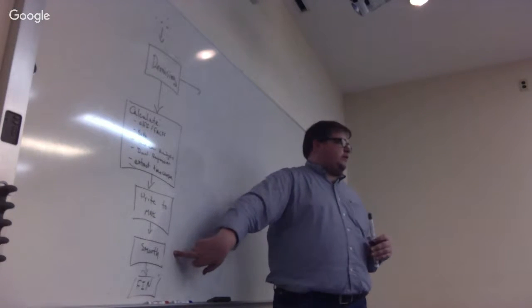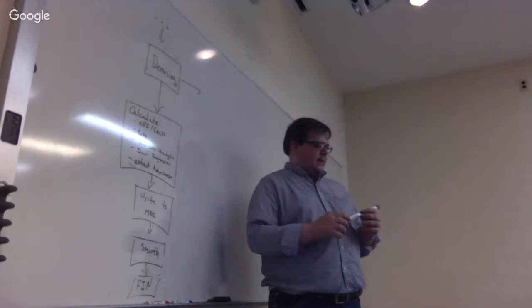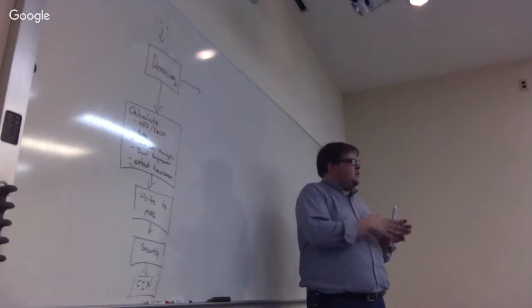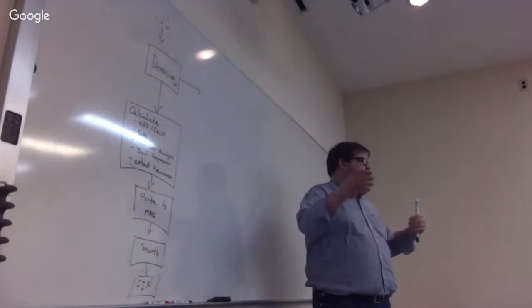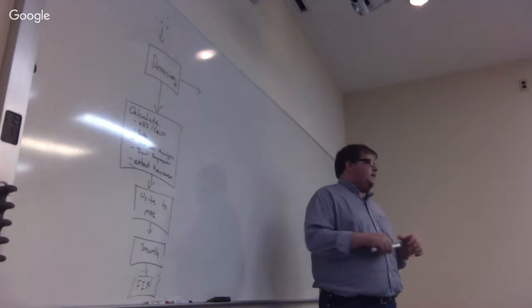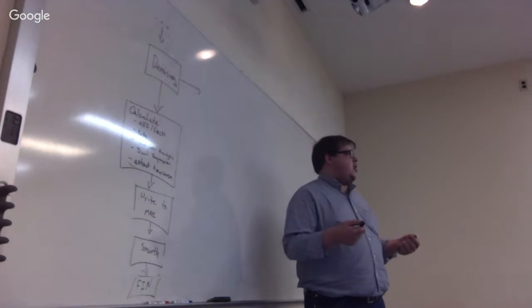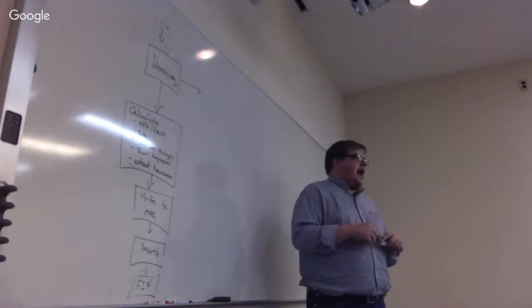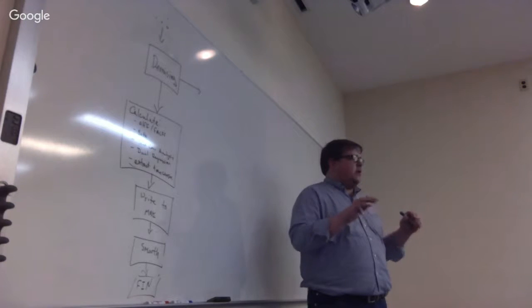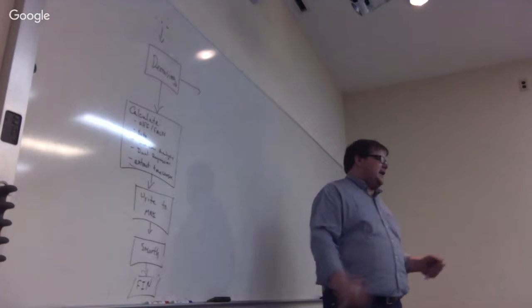So why do we smooth after we calculate the individual analysis? Very similar to task-based analysis, the goal of smoothing is to improve the alignment of brain regions across individuals, right? And it's also there so that assumptions regarding things like Gaussian random field theory are more appropriate and can be more appropriately applied to the data. Also, it improves SNR, right? Signal to noise ratio. How it improves SNR is essentially by averaging. So typical noise, we assume, is zero mean, right? So if you average it together, then it goes to zero. And so that's what we do.